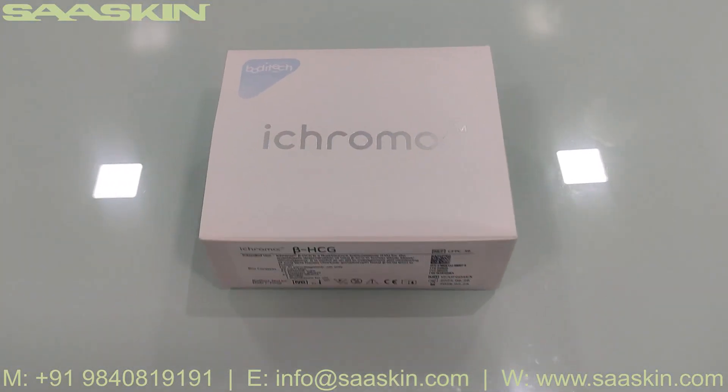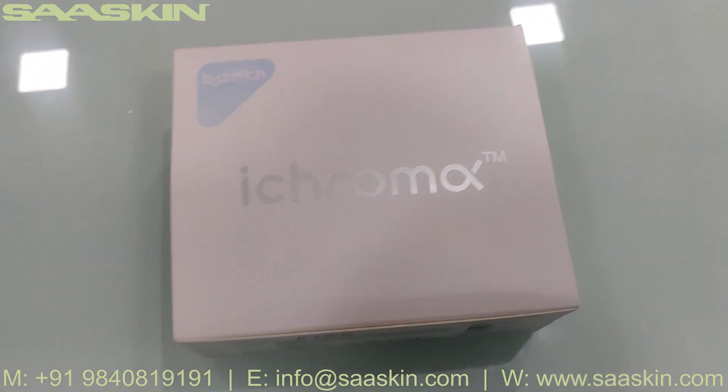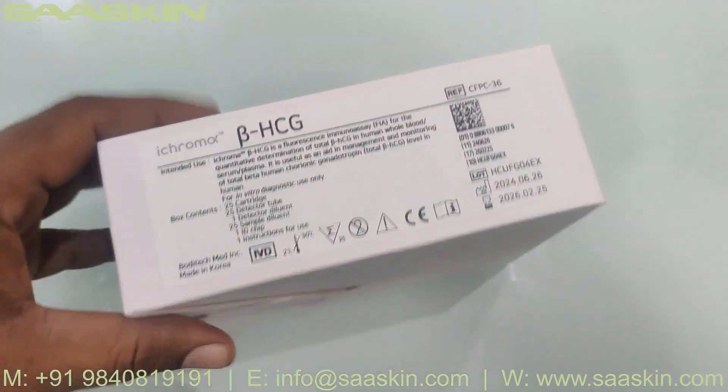Hello everybody, today we are going to see the unboxing of BodyTek iChroma Beta HCG test kit.